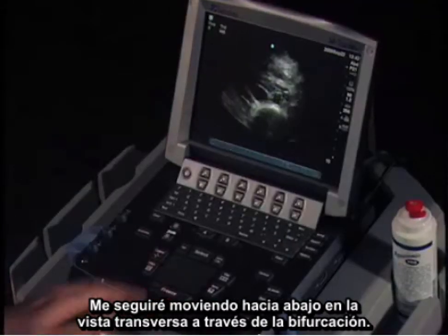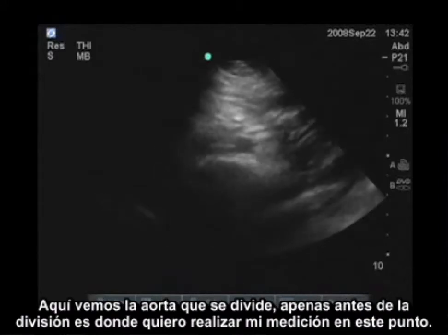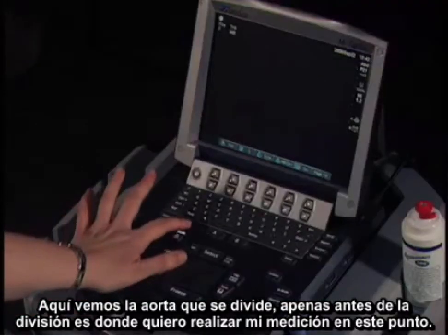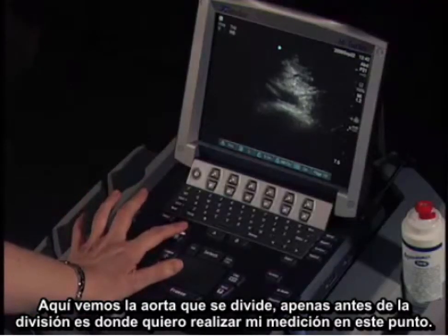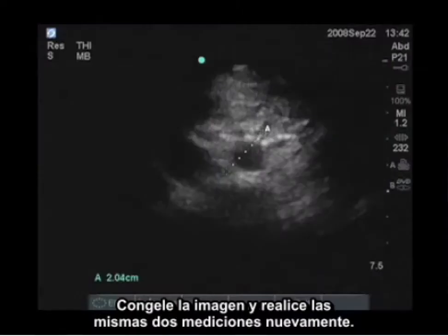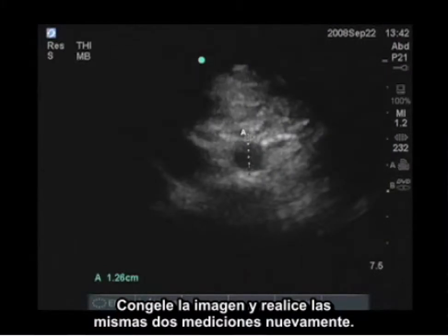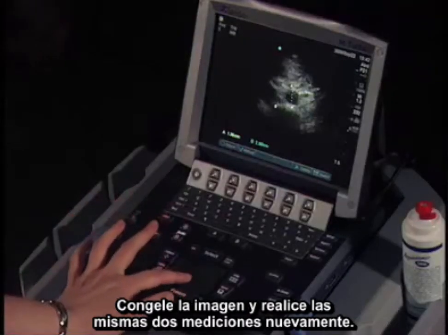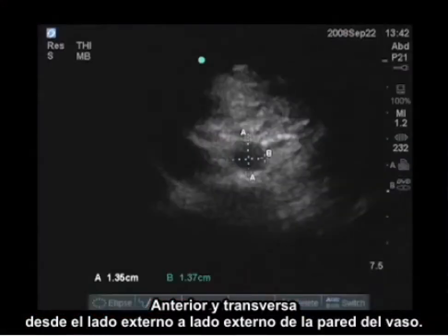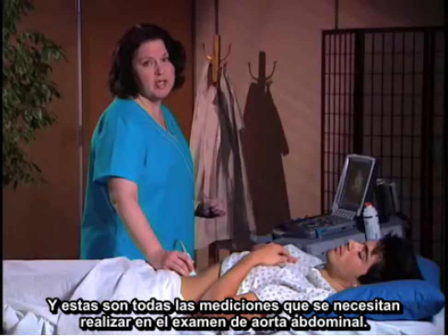I'll keep moving down in a transverse view towards the bifurcation. Here we see the aorta divide, so right before it divides, I want to perform my measurement at that point. I will freeze and perform the same two measurements again — anterior and transverse, from outside wall to outside wall. And that is the completion of the measurements needed for the abdominal aortic exam.